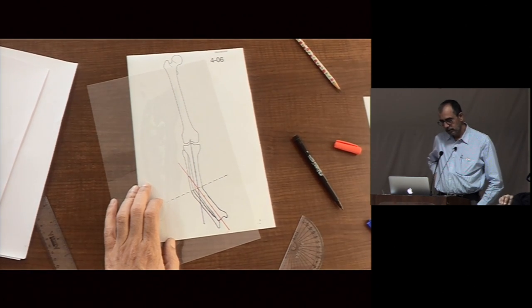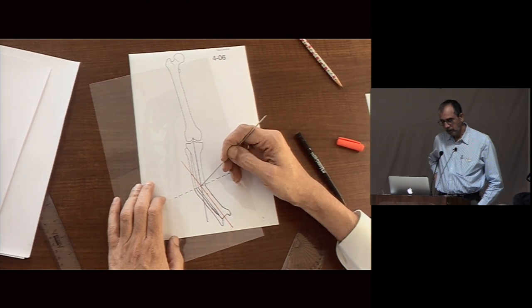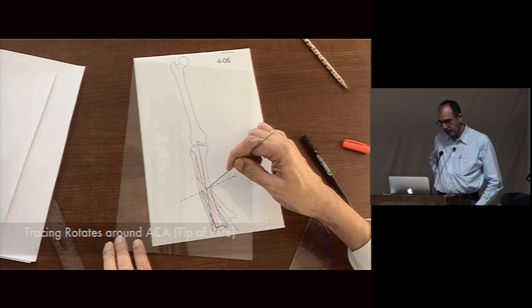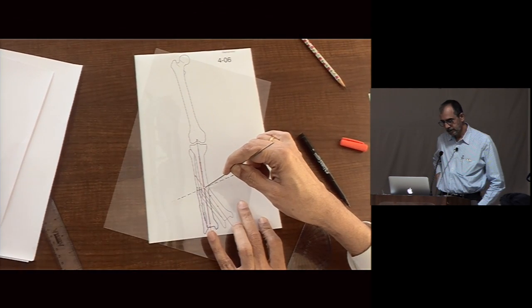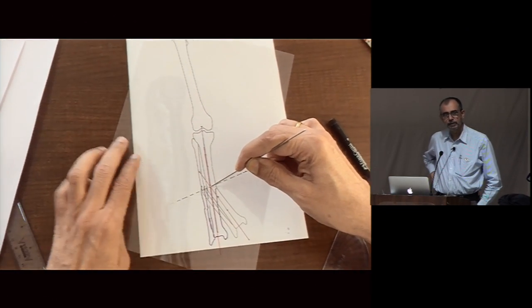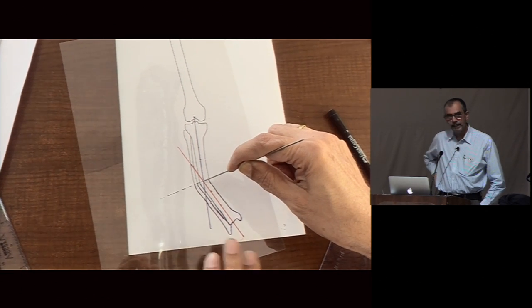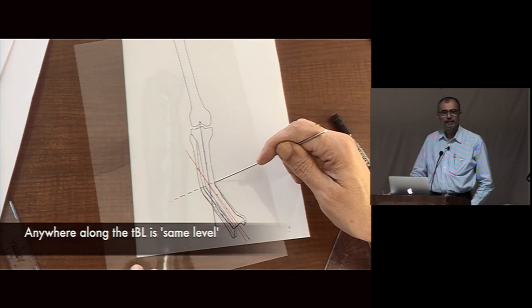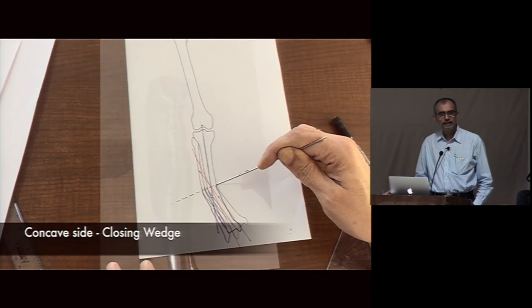Now where should my hinge be? On the bisector line. Okay. So I put a pin there and I am correcting it and checking. So I have now an opening wedge. So even if you don't have software or a computer, you have an OHP.